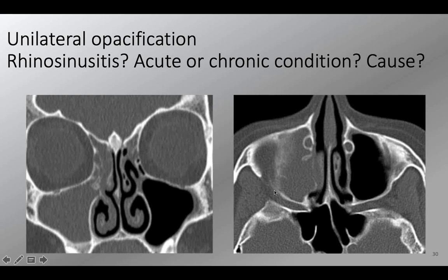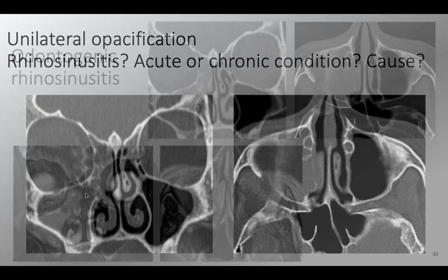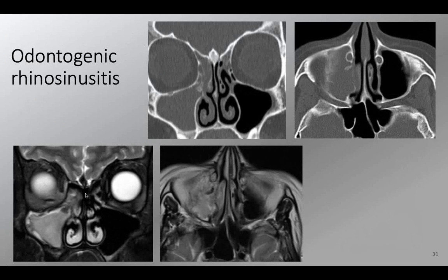And as we see, there is no sclerotic thickening. But we have something in the sinuses close to the ethmoid infundibulum. So actually this is, I call it, odontogenic rhinosinusitis. It's actually a part of a tooth that had loosened and gone into the maxillary sinuses, and now it's trapped in the ethmoid infundibulum and causing sinusitis. On MRI we see it as a signal void close to the ethmoid infundibulum, and also see how close the ethmoid infundibulum is to the lacrimal duct.